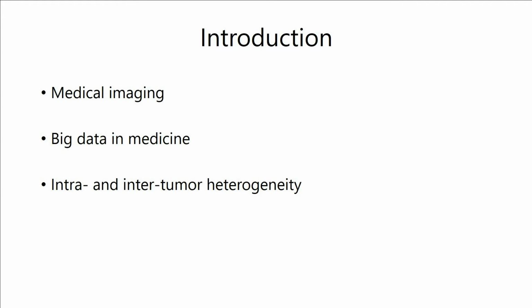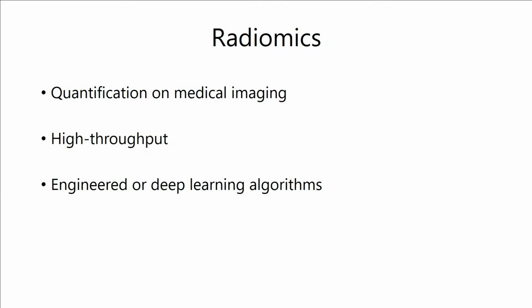Medical imaging is considered as one of the top innovations that has significantly transformed clinical cancer care. More recent developments have pushed towards the generation and mining of high-dimensional patient data, or big data. Additionally, there is increasing evidence suggesting the vital impact of intra- and intertumor heterogeneity on cancer treatment response.